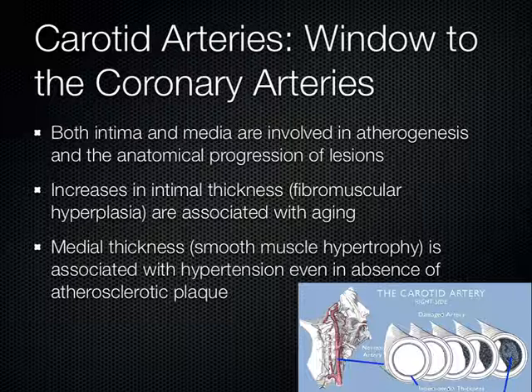Surrogate markers are not perfect. They're not like pathology looking straight at the disease itself, but they are convenient, non-invasive ways of checking for stuff going on in our patients. Same thing with this carotid artery intimal medial thickness, or CIMT.